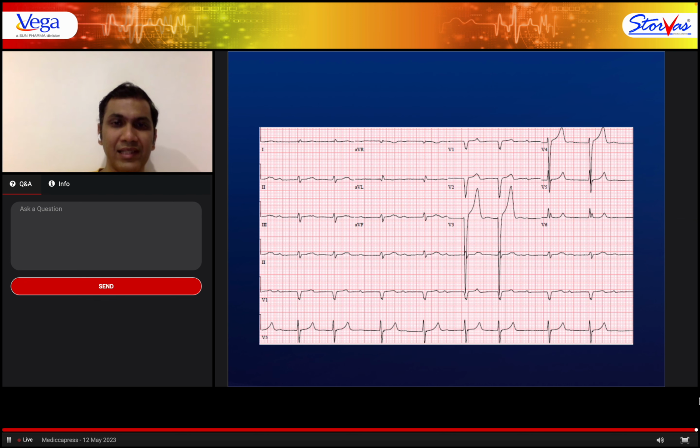Now let's take a look at this ECG. This ECG is a little bit funny because in this ECG, again, you can see a widish QRS complex. You can see fragmentation in leads V5, V6. And I have to look very, very hard to start seeing the P waves. In V1, the P wave seems positive. I can't see any P waves very well in this particular ECG, although perhaps there are low voltage P waves that you can see, which makes you worried for a coexisting underlying substrate.